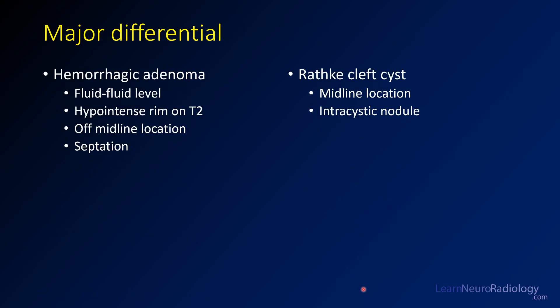The major differential in this case is whether it's a pituitary adenoma with hemorrhage or a Rathke's cleft cyst. Features favoring adenoma include fluid-fluid levels, off-midline location, and septation. Rathke's cleft cysts tend to have a midline location. There's also a classic intracystic nodule — a small nodule along the margin — which is classic for Rathke's cleft cyst.